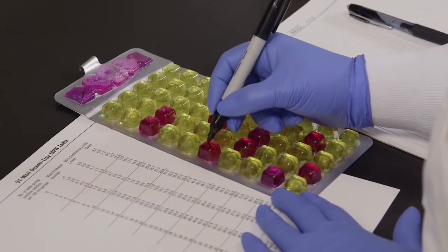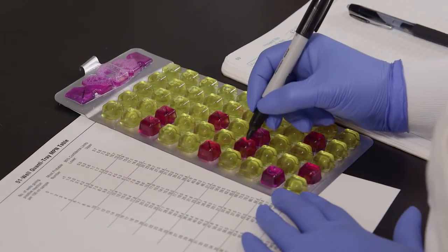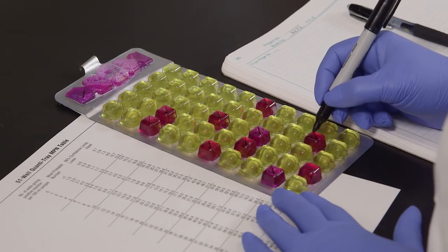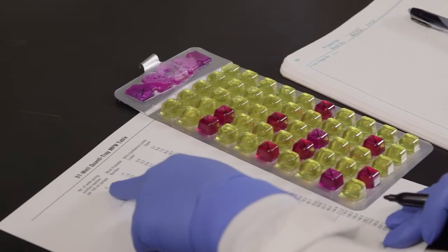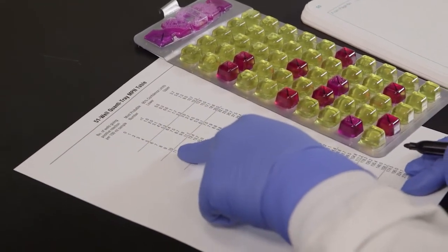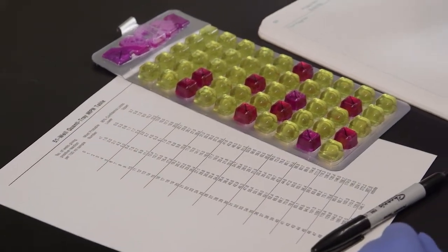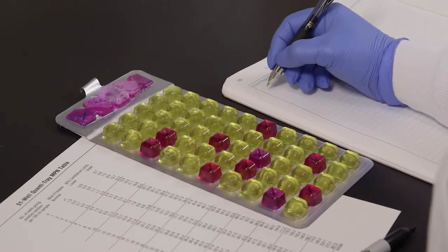To determine the number of total coliforms, count the red or magenta positive wells, and then refer to the MPN table included with the QuantaTrays. The most probable number of total coliforms for this example is 12.4 per 100 ml. If using QuantaTray 2000, count the overflow well as a large well.